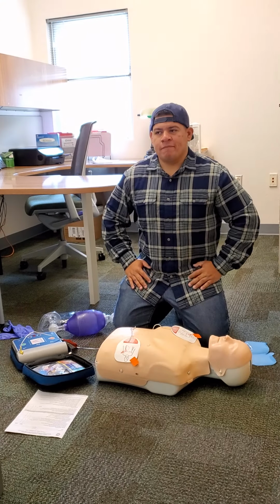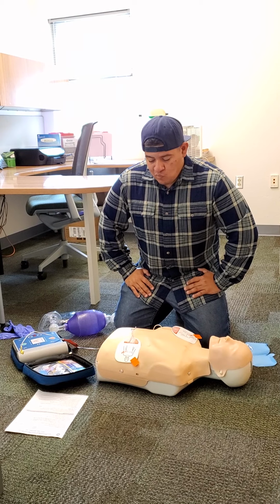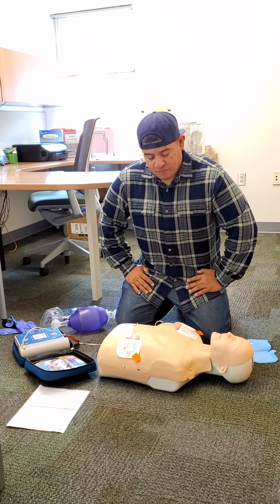Analyzing heart rhythm. Do not touch the patient. So we're going to make sure that nobody's touching the patient. Whoever was doing compressions and ventilations, they're not touching anything that's touching the patient, because we want the AED to analyze only the patient.